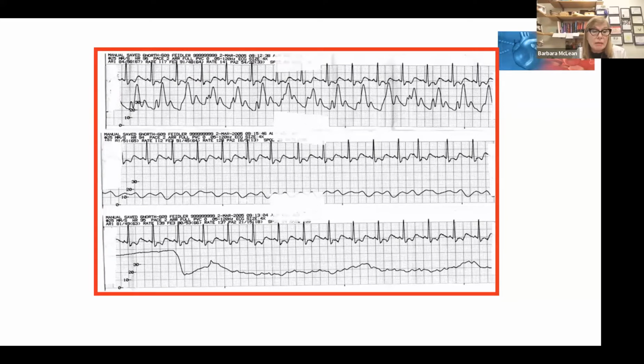If the PAD is significantly higher, more than 5 higher than wedge pressure, I cannot use PAD to reflect left heart. I can't, and I should not, and I won't agree to it. I'm sorry. If you want to know about the left heart, you need to come in and wedge the catheter, or you've got to give me permission to do so, one or the other. That's it. I'm not going to use PAD to reflect LV filling because the gradient is too high. That happens when you have pulmonary hypertension, but normal LV filling. So when you have pulmonary hypertension, you're going to expect that PA diastolic to be higher and the wedge to be normal. But the gradient is profoundly important in terms of how we look at our patients.